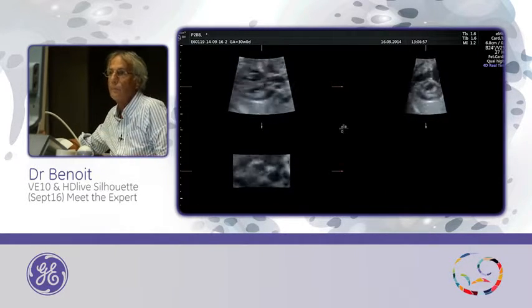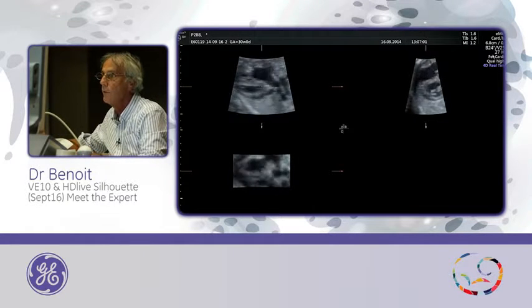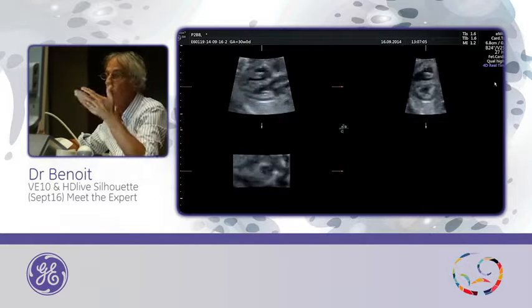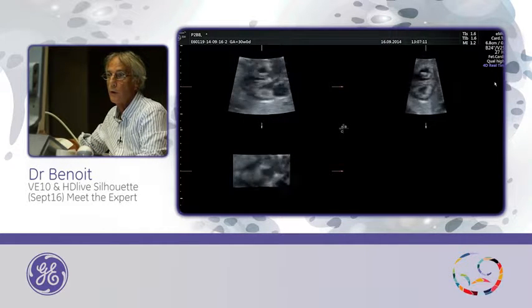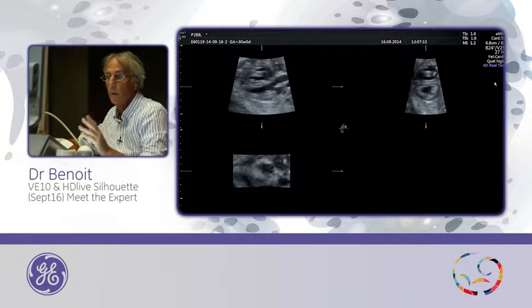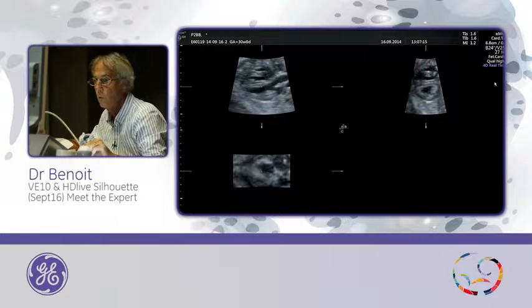This is real time, with a frame rate of 27 frames per second, volumes per second. That means here you can do one examination like this. You can sweep, you can save it, and now you can play the loop.